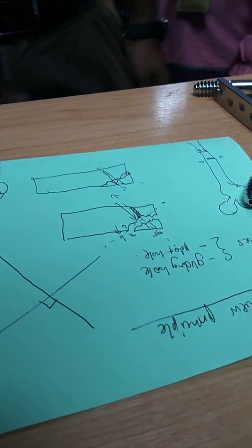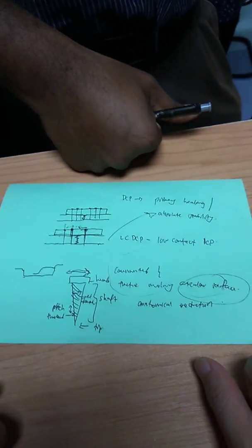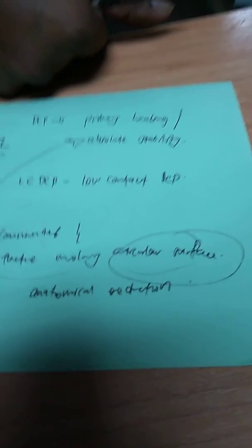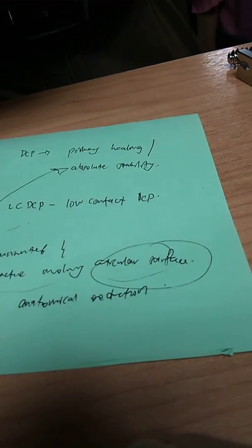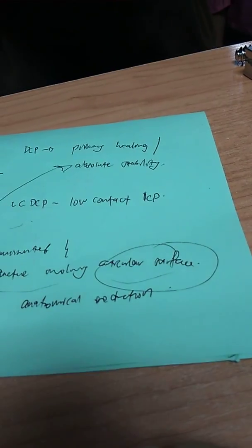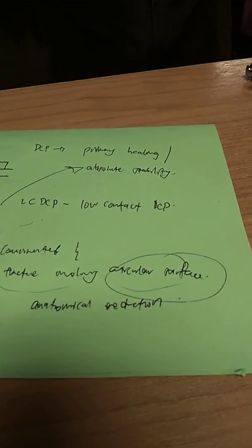How come with a plate, is there a time where there is a need for removal? What kind of plate you ask? Let's say this is now a bridging plate. Okay, it depends. If the bridging plate is used for fracture healing, you can leave it there unless it's disturbing your movements. For example, a buttress plate of the distal radius sometimes can affect the movements.